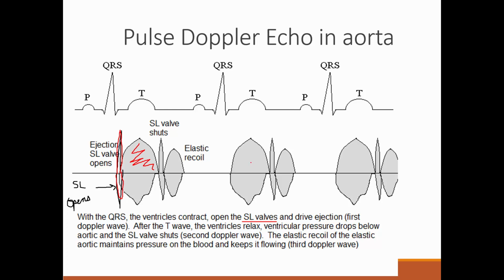So in my legend here, I have this labeled 1, 2, and 3. However, when Dr. Katz showed you this last week, we were able to see that first signal, and he talked about 4 signals. So from Dr. Katz's perspective, this is 1, opening the valve.